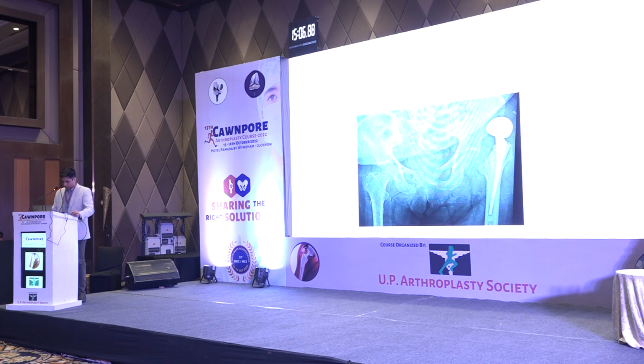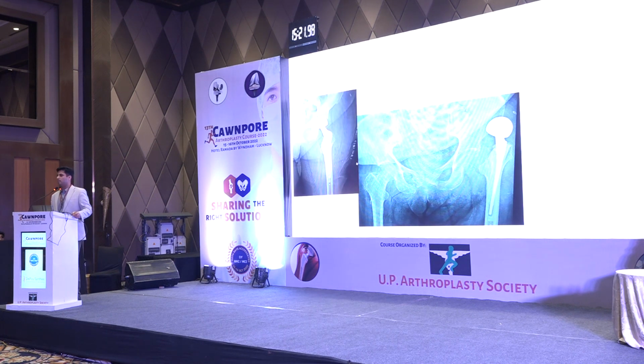All right. And the last case was actually done by my junior while I was at a conference like this one. He did a fracture neck femur, he did a bipolar, and that dislocated in a month's time. And the reason I found out was that he had given too much lengthening, not understanding that the soft tissues were supposed to be respected. You should not try to get them to a tension other than what you have on the opposite side. So this is what the immediate post-op X-ray was, and this is what happened in a month.